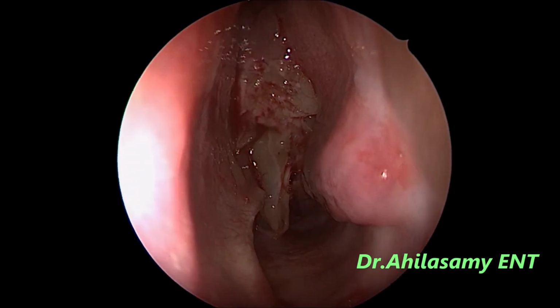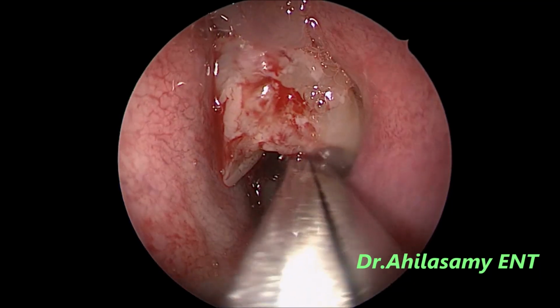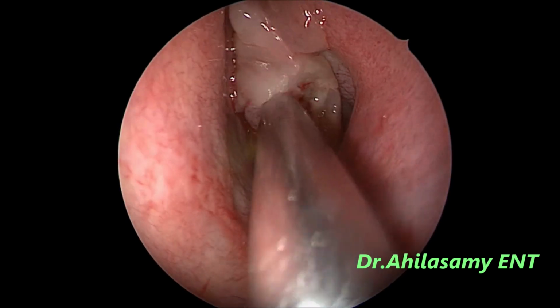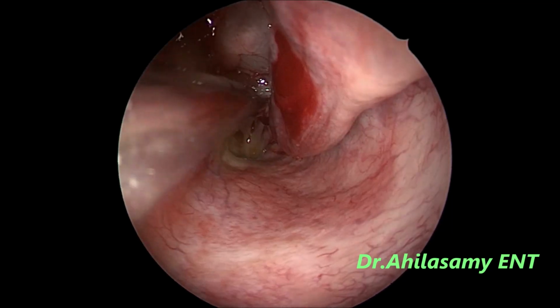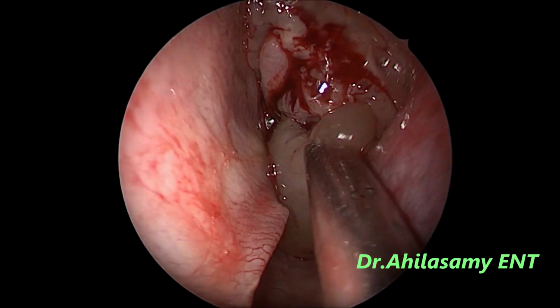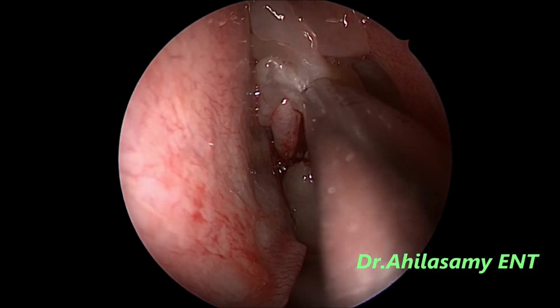I am taking more polyps for biopsy because I should not miss an IP in this case, that is inverted papilloma. But clinically, it is a very clear-cut case of sinonasal polyposis or a CRS with NP. Still a lot of polyps in the choana and nasopharynx, which I am trying to shave out with the debrider system.